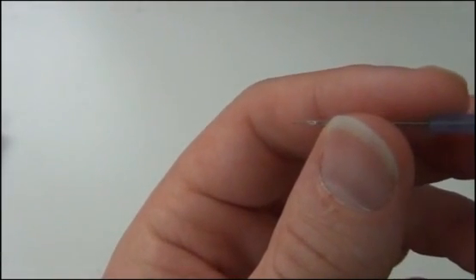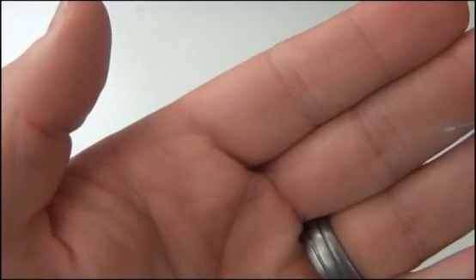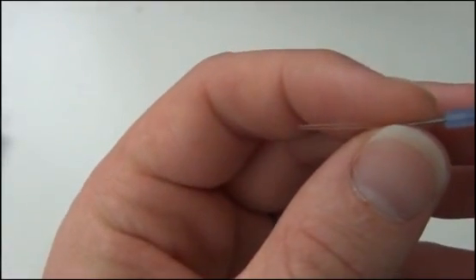Once we're in the vein, we advance this, if you can see that, we advance that catheter. And that catheter is what sits inside. And the needle actually comes out, of course.